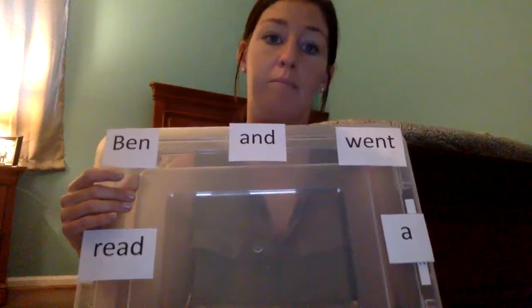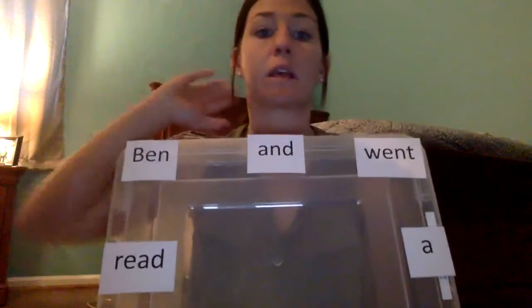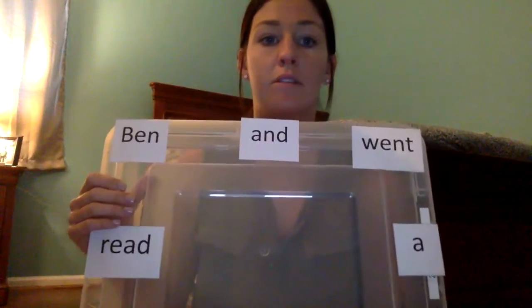As John progresses educationally with the low-tech device, it too can be expanded. In addition to the X coordinates, which were demonstrated, the device can be expanded to either 6 or 8 plus coordinates. To alleviate any confusion, the plus coordinates would require a double head motion up with an eye gaze, or a double head motion down, or a double head motion to the left or to the right, along with the eye gaze gestures. Then the plus coordinates can be incorporated to the X coordinates in order to allow for more advanced responses.